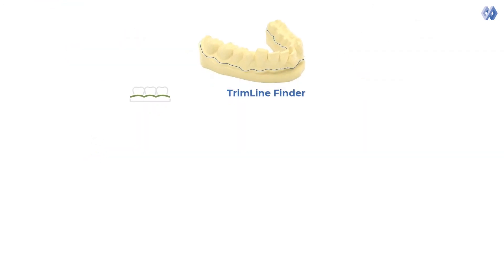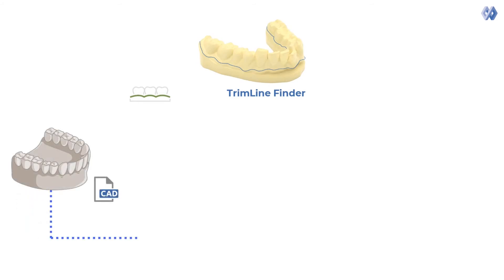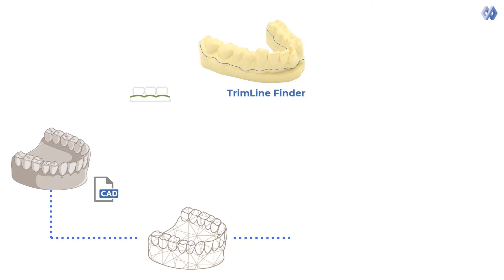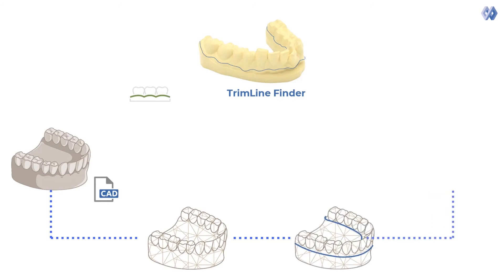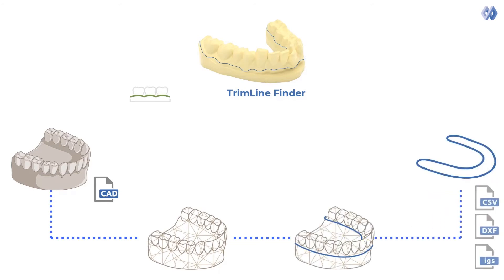Clear Aligner Trimline Finder imports the patient model and automatically identifies the optimal trimming line, with optional user defined input. It then exports the data in various data formats.